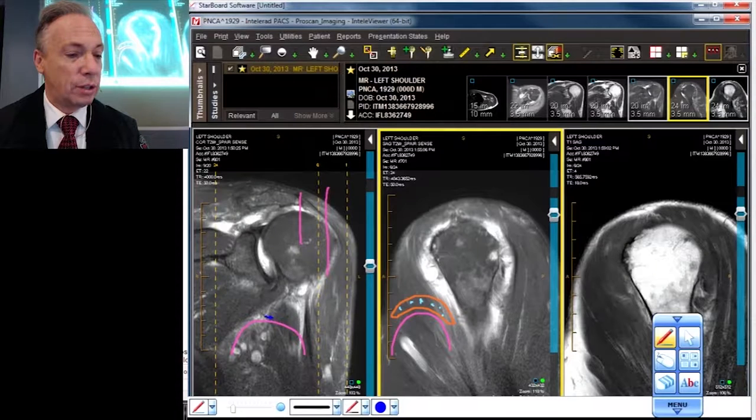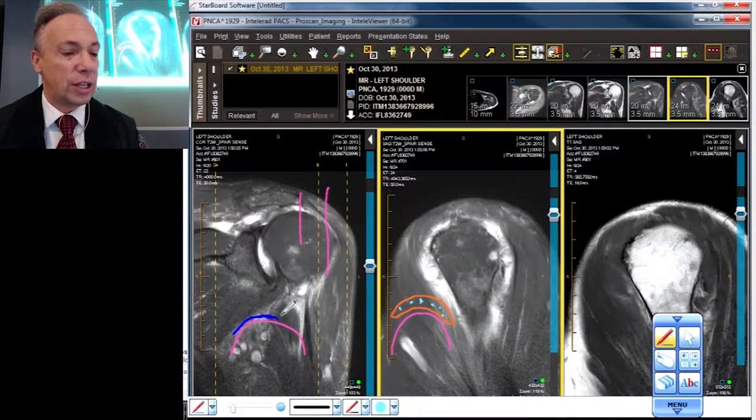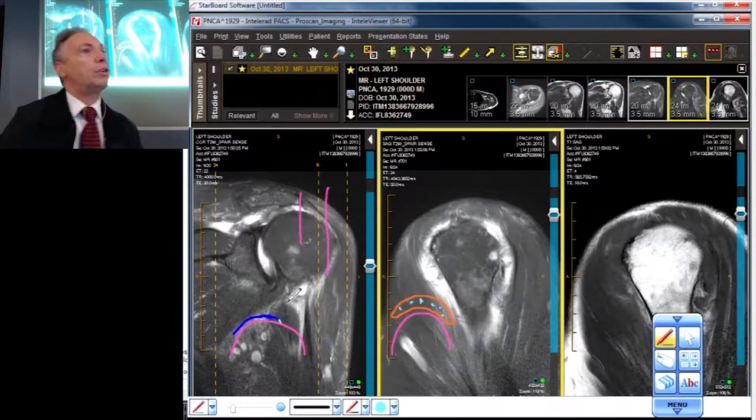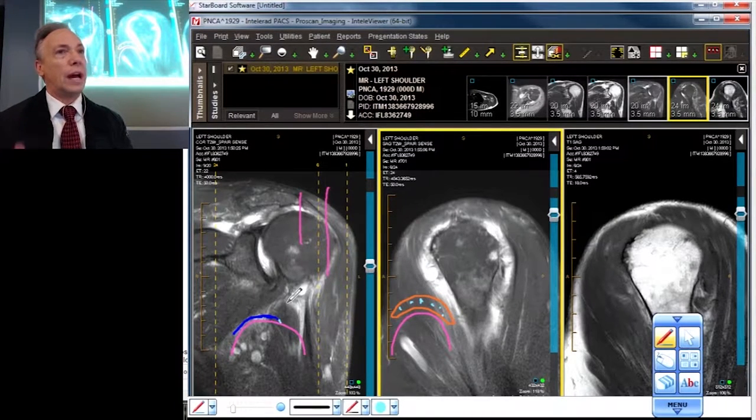You may see multiple round spots near each other, or they may be one contiguous black band. Then you'll often see a little bit of lighter signal right there, usually in the posterior one third or middle third of the humeral head.